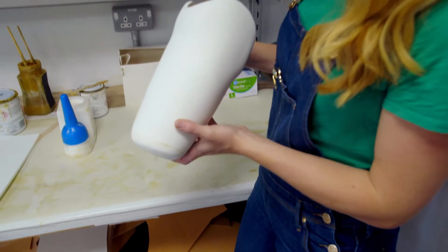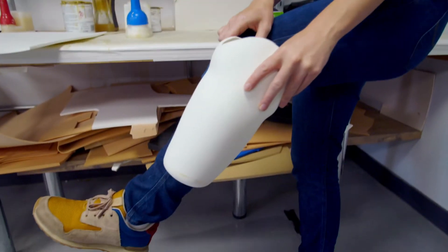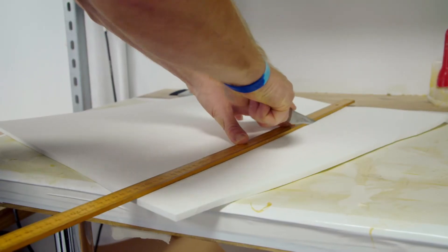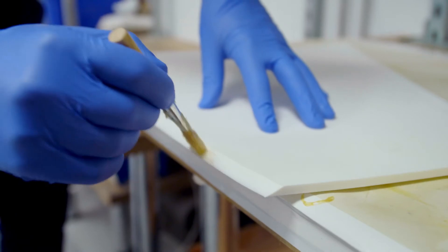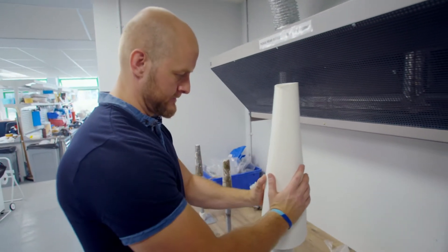The next part that Adam's making is called the liner. And the liner will fit over the person's leg, so it has to be nice and comfortable. So it's made from this spongy foam, which Adam cuts, glues and shapes around the model on a machine called a vacuum former.